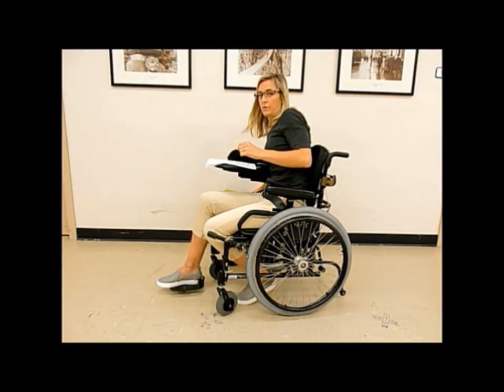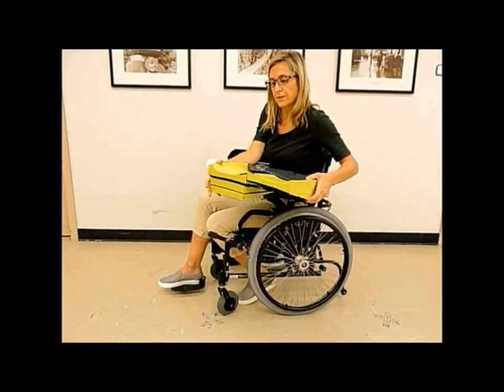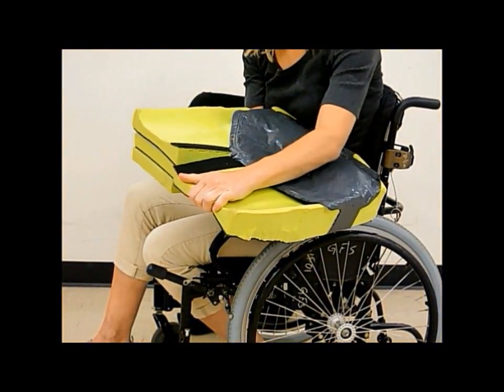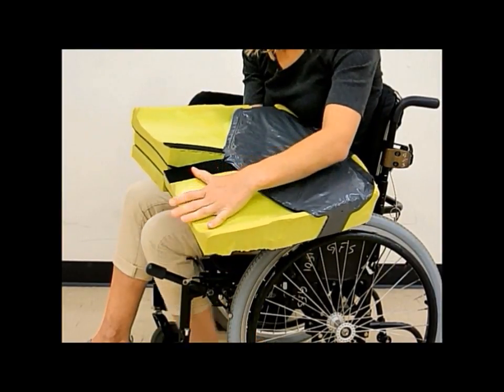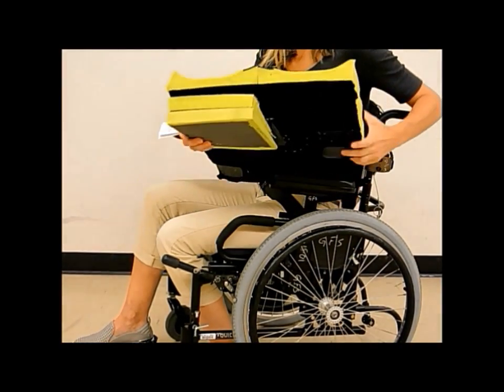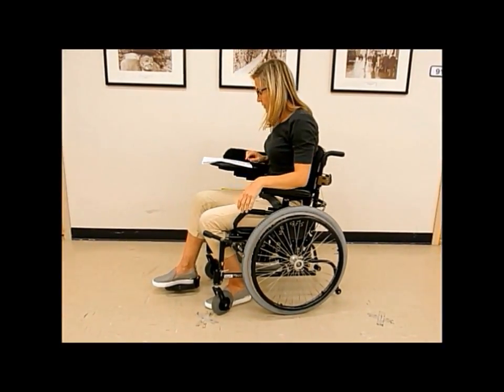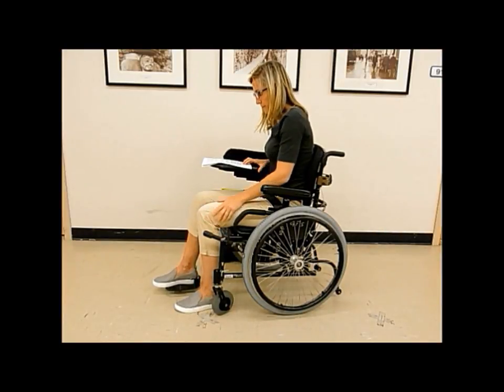So I have an example of a cushion that has been built up to support the leg that's under the footrest, and this one is lower, so the leg trough is lower for the propelling foot. That's an example of modifying a cushion. So make sure that the front edges of the cushion don't touch the back of the calf when wheeling.